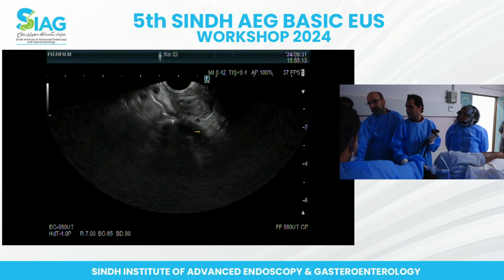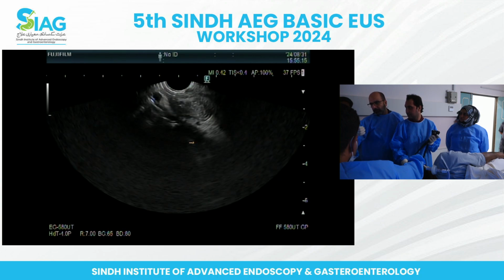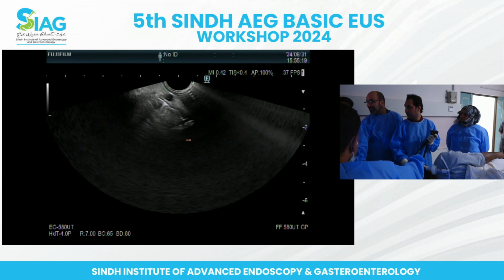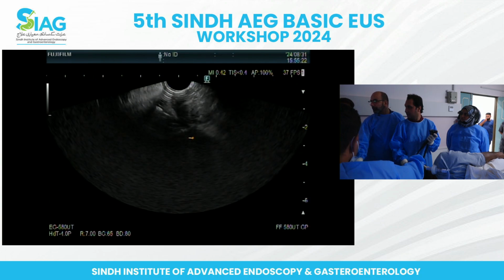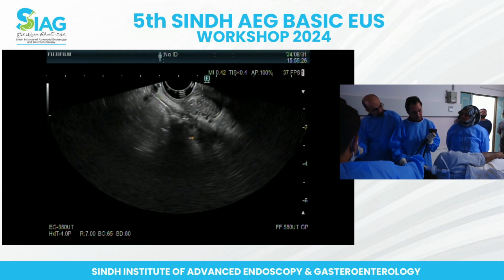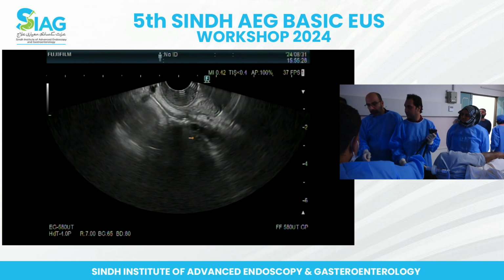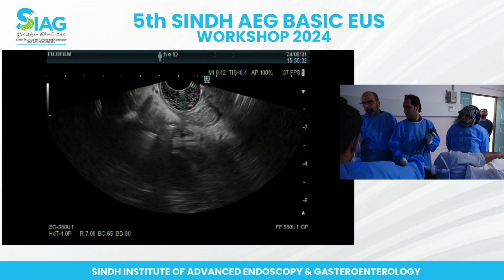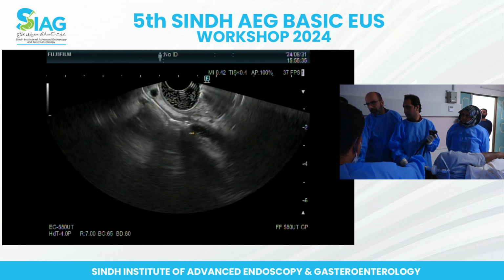Now go clockwise. Big wheel towards you to bring it closer. Suction, suction, suction. You can try and put the balloon up here because you see that air in the lumen. Are you sitting on the air or no? No, I'm not. Okay, good, just press the balloon now. Okay, good. And that's enough. That's a lot of balloon. Okay, good. Now suction and go clockwise.